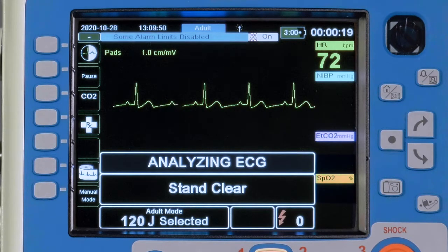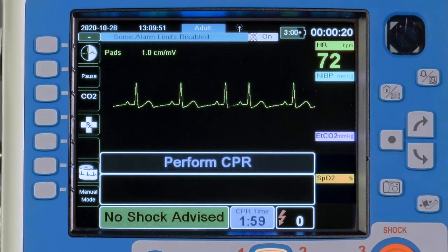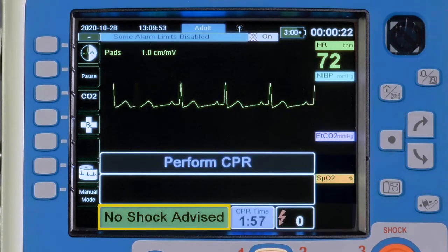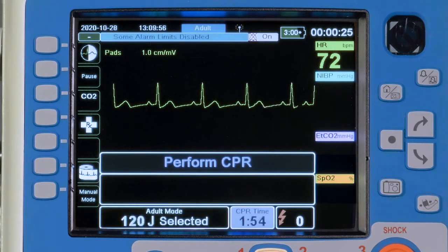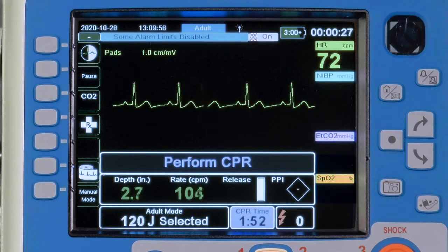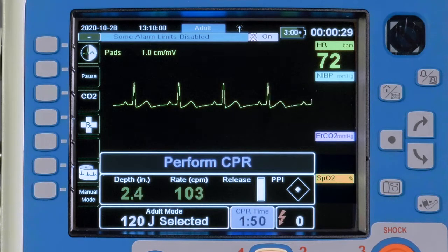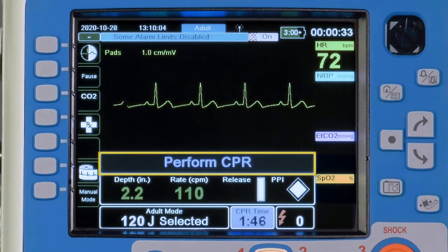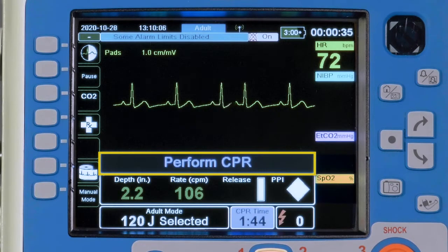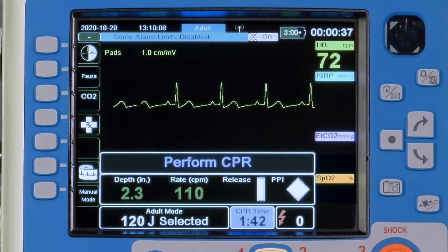If the device indicates No Shock Advised, a message advising Perform CPR will be displayed with audible notification.